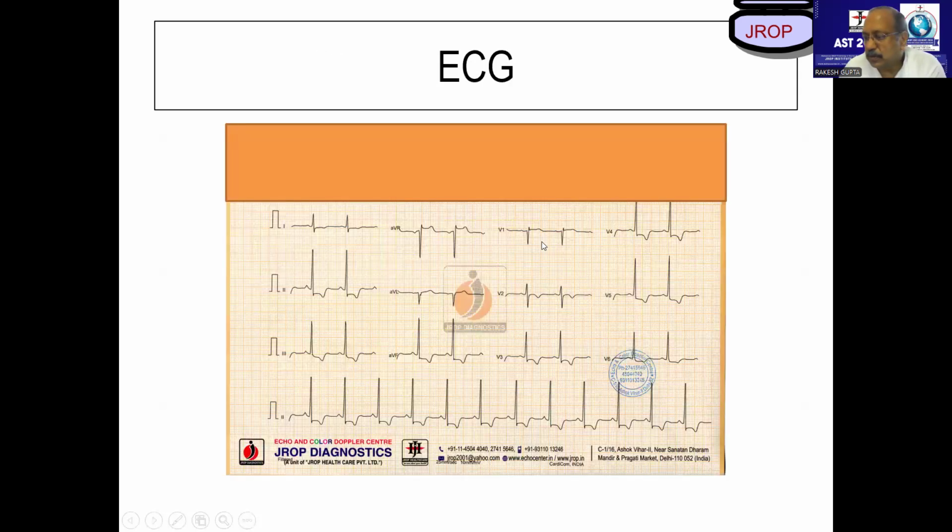And look at his ECG. What do you find in this ECG? All of you are top class physician cardiologists and masters of ECGs. Strain pattern is there. LV strain pattern, sir. Where does this LV strain pattern lie? Lead 1, AVL and V5, V6. Correct? Yes, sir.